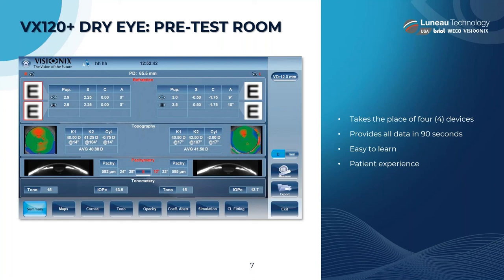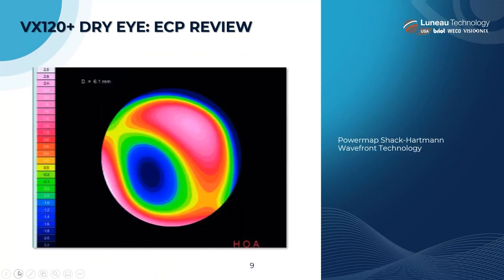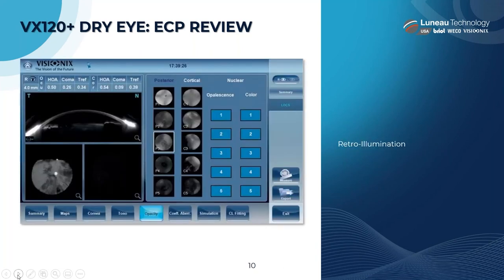Here's a preview of the anterior segment summary screen on the VX120 Plus Dry Eye — this is what that summary screen looks like. This shows you the anterior corneal topography screen and the higher order aberration screen. It's amazing technology that this equipment can capture all of these different measurements with one patient sitting.